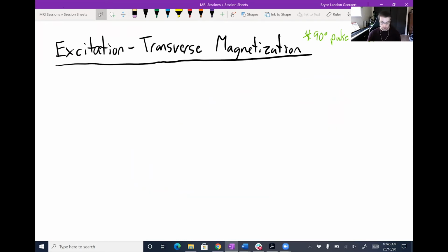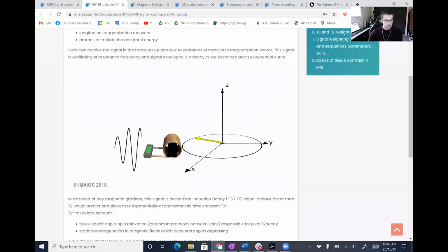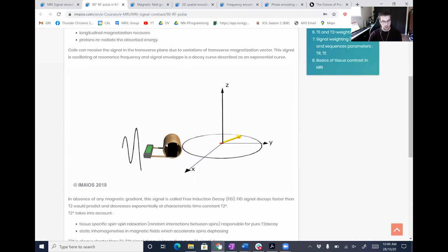It'll be great. Okay, so refreshing us on what's going on with the transverse component. It's got all this precession going on, which is great. We're looking at the yellow arrow now. And over time, it's actually decreasing or decaying, getting smaller as the NMV in orange returns to that longitudinal orientation. The transverse component disappears. And I mentioned before, this happens much more quickly than any change in the longitudinal component, which you might be able to appreciate here. It takes quite a while for the red vector to become large, whereas it happens quite quickly that the yellow vector there becomes smaller.